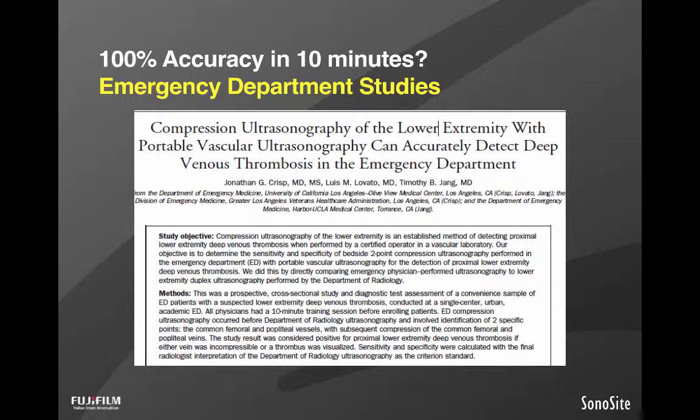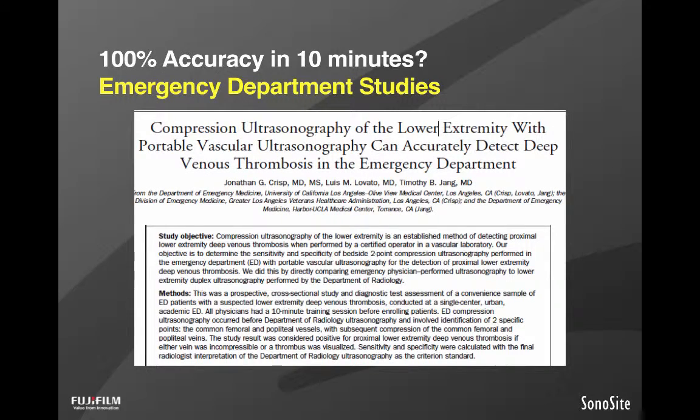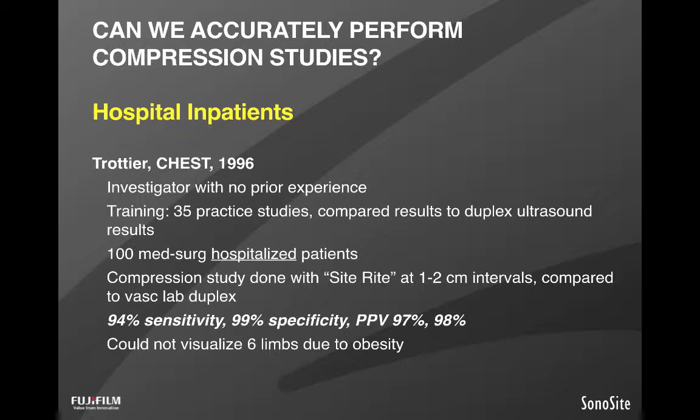This one makes me a little nervous in that the training provided to these ED physicians was only 10 minutes. But oddly, with 10 minutes of training, they achieved 100% accuracy in these patients. This was 100 patients, and they got every single study correct when they compared it with the Department of Radiology studies. Although I think this is a remarkable result, and it shows that this is probably a very easily acquired skill, I would still be measured and say I think you need more training than 10 minutes. I'm glad that they were able to achieve that, but it's not something that I would recommend.